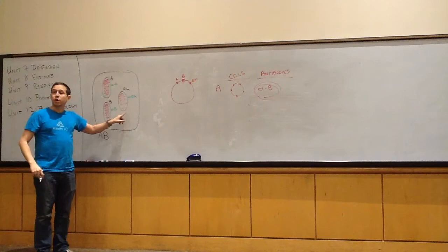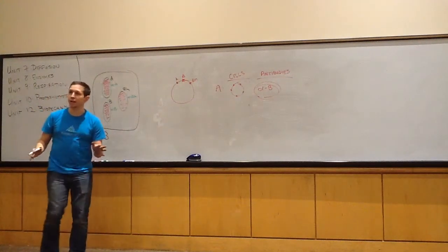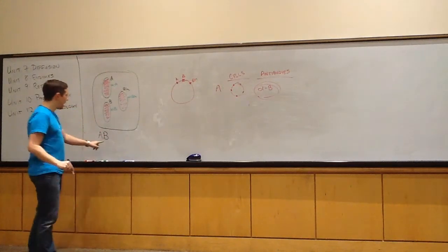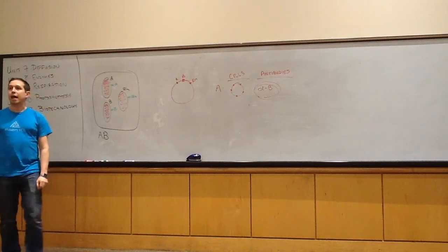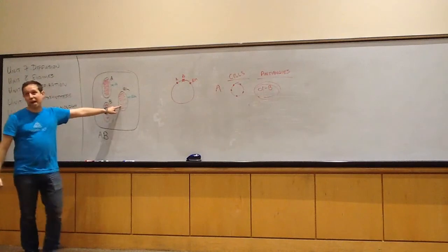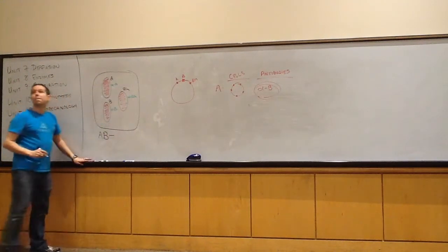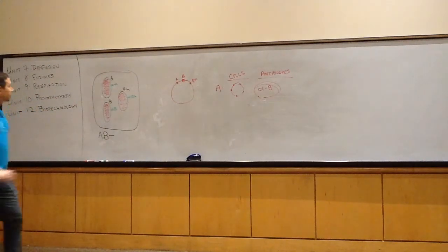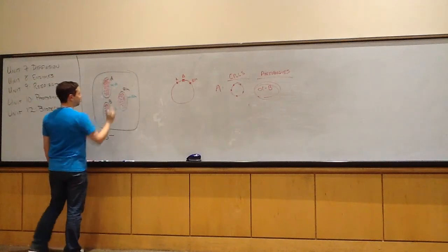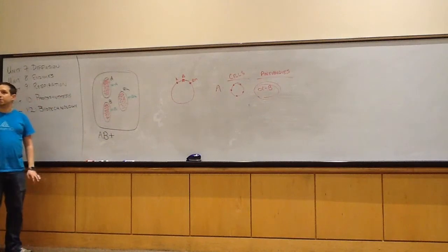Finally, you're asking the question, do they have RH or not? And you're looking for the same thing. If you see a reaction, they do have RH. But we don't write ABRH, we write AB+. If, however, you don't see a reaction, like right here, you write down minus. So if this person instead did have that particular reaction, where we see the agglutination, we write AB positive.